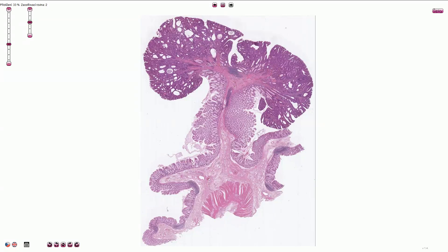On this slide we can see a colonic polyp and here is the normal colon. Here we can recognize the mucosa, muscularis mucosa, submucosa, and muscularis propria.